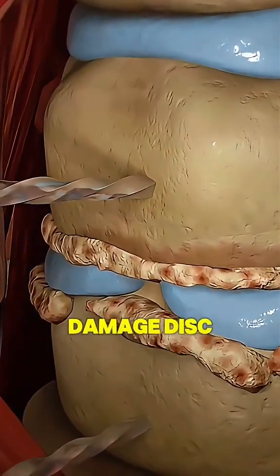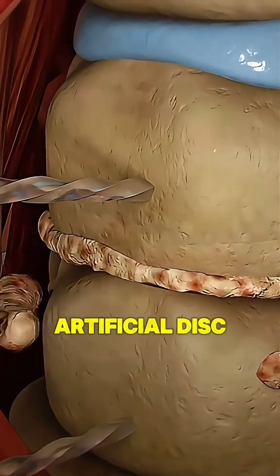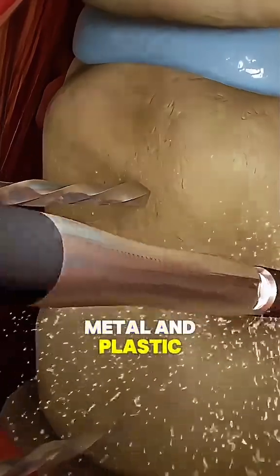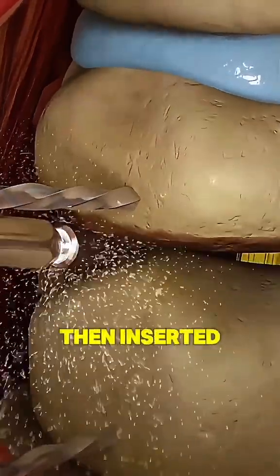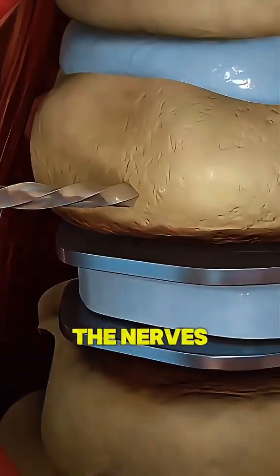Using advanced imaging, the damaged disc is carefully removed and the space is prepared for a new artificial disc made of metal and plastic. This new disc is then inserted, mimicking the natural disc's function, allowing for better movement and relieving pressure on the nerves.